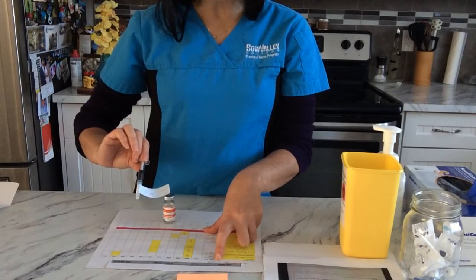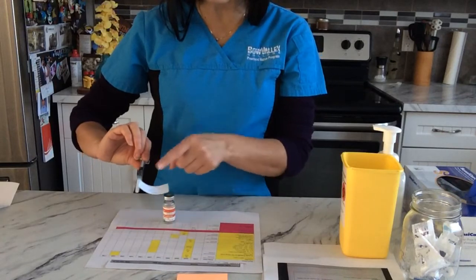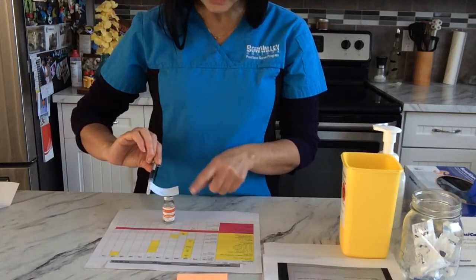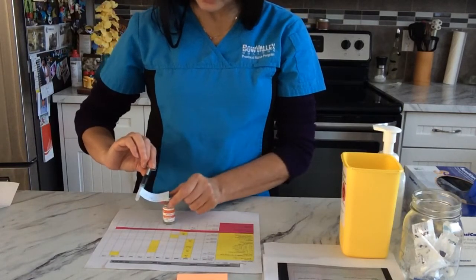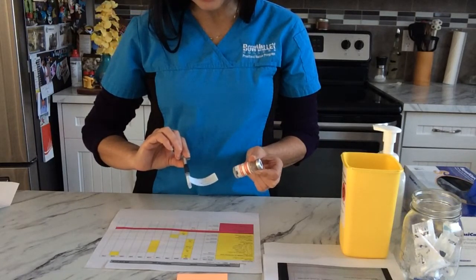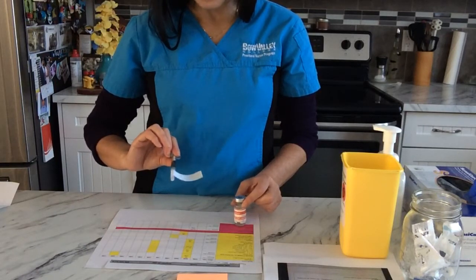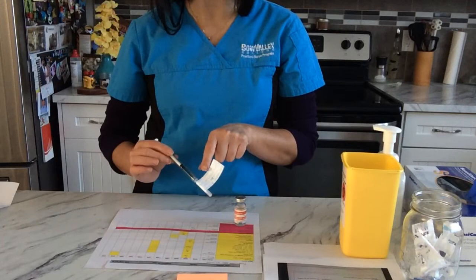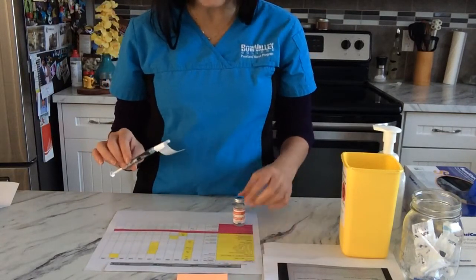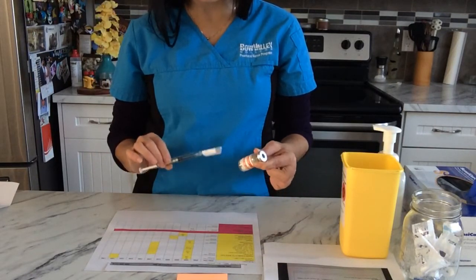Today's date is December 1st, 2020. It is 10 o'clock. This is heparin 5,000 units, subcutaneous route. I have here heparin 10,000 units, and we did the med math and we withdrew 0.5 ml. Subcutaneous route and my initials. So my label matches my MAR and my vial for the drug. So I got the right drug.